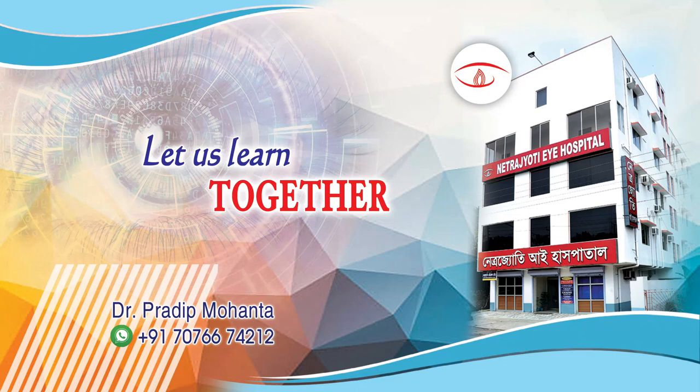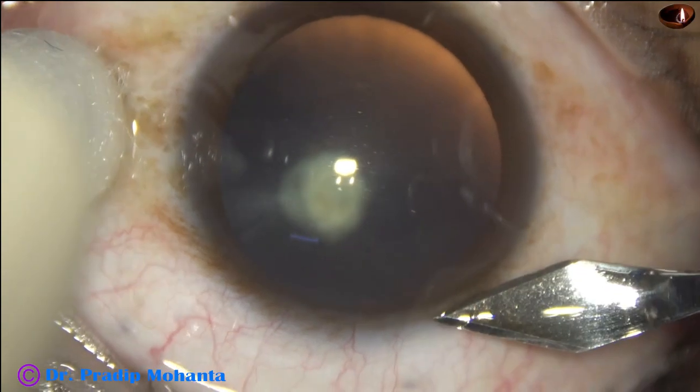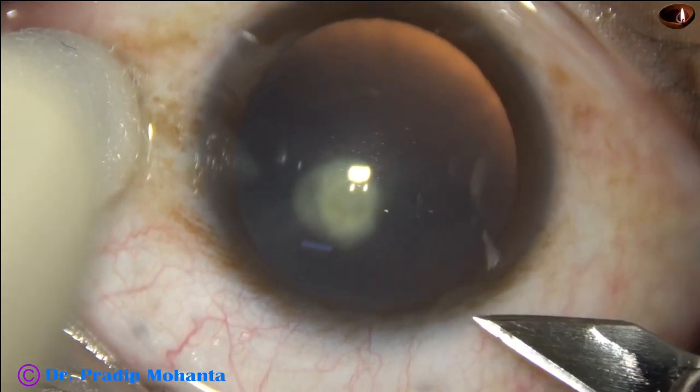Friends, welcome to my workplace at Ranakhart, West Bengal, India. In this video, we are going to see management of a posterior polar cataract.